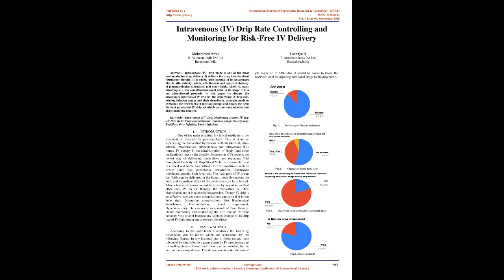This is done by supervising the medication by various methods like oral, intra-arterial, intramuscular, subcutaneous, and intravenous (IV) routes. IV therapy is the administration of fluids and other medications into a vein directly. The intravenous route is the fastest way of delivering medications and replacing fluid throughout the body.